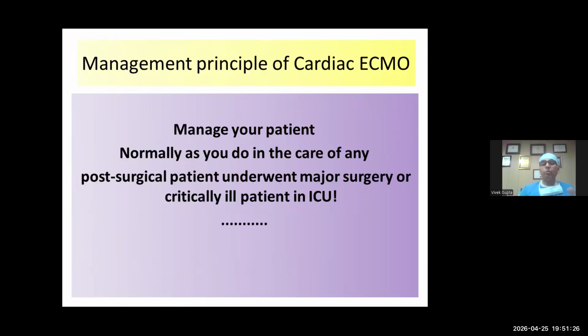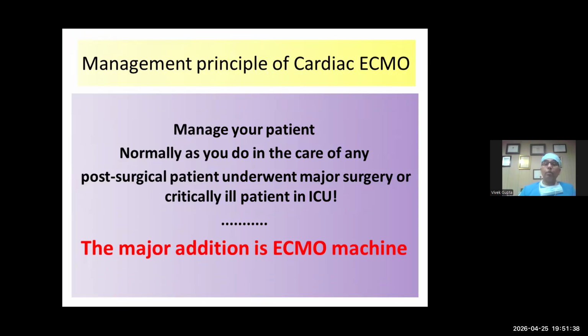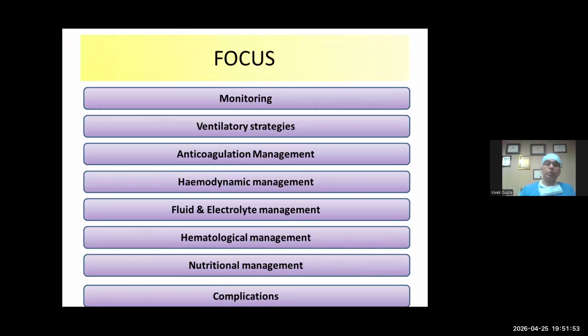So what is the management principle? Manage your patient as you normally do for any post-cardiac surgical patient who has undergone major surgery, or any critical patient in the ICU. But your major addition is the ECMO machine. And you have to ensure that this machine is not causing any harm to the patient, and that we are maintaining an optimal flow so that we achieve the best benefit for the patient.